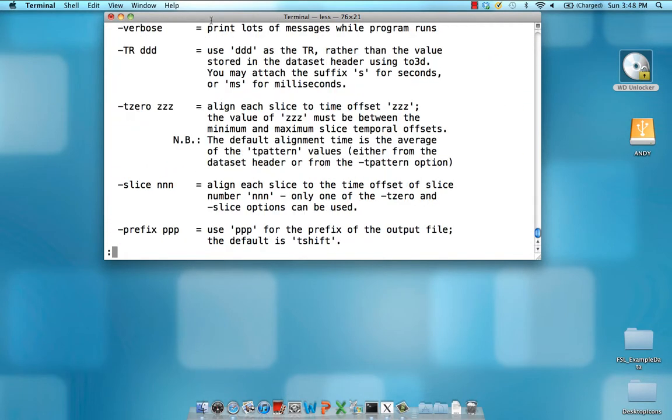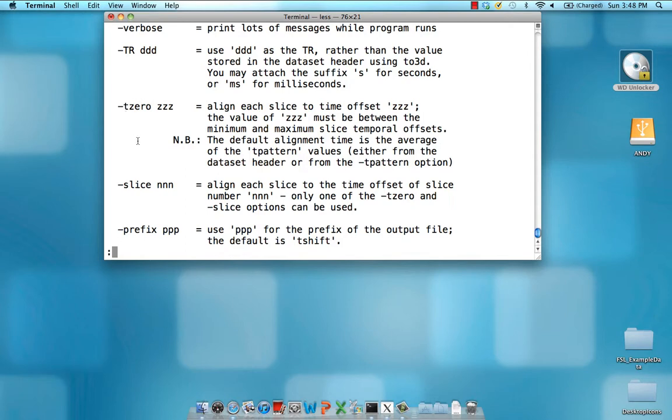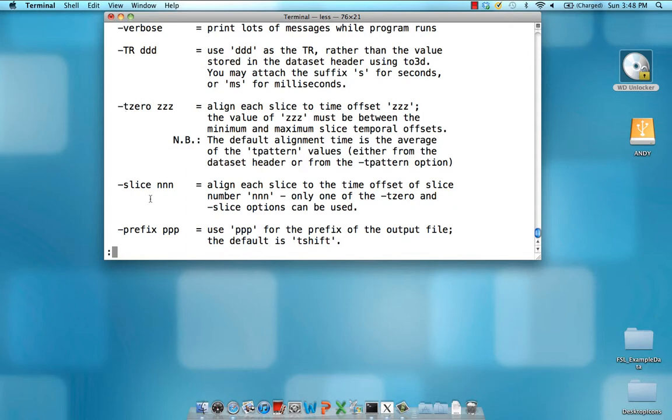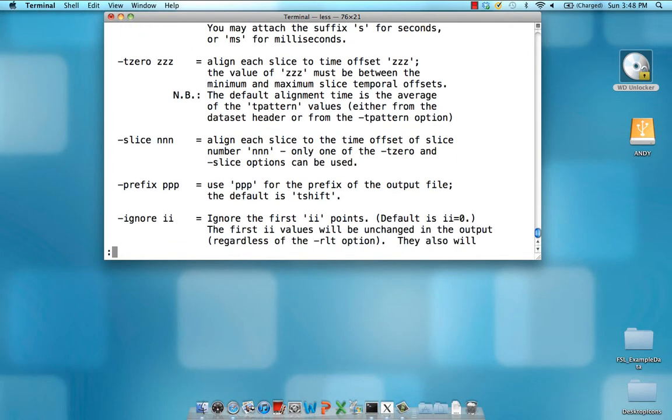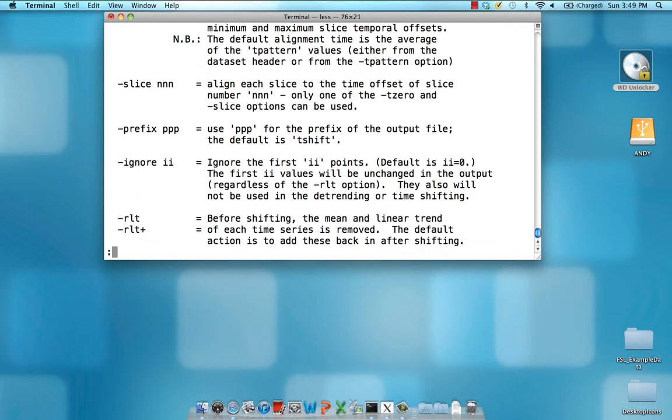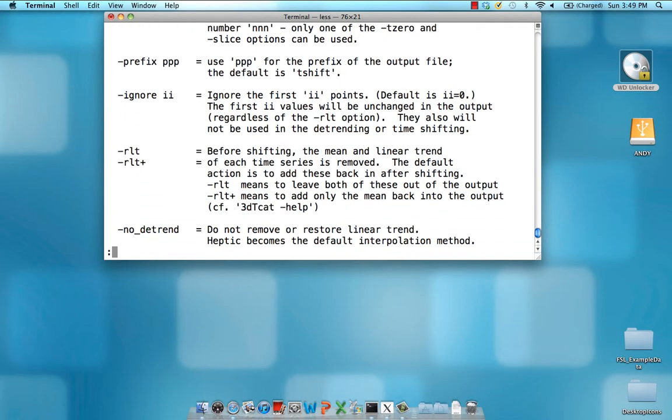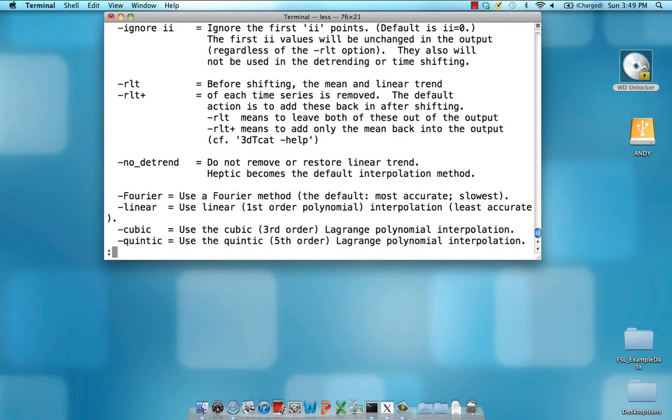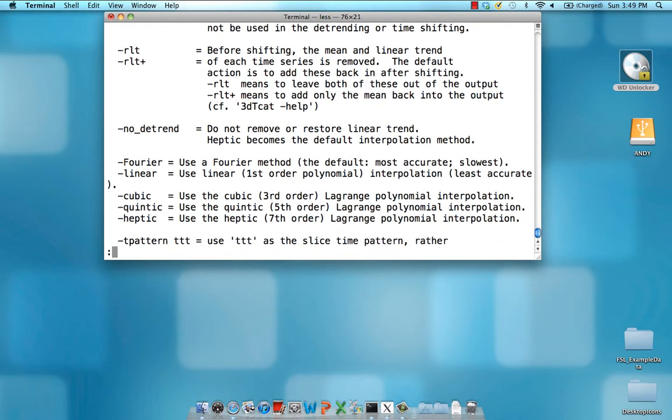Notice that there are different options here, such as you can override the TR stored in the data set. You can set what slice you want to align to. In this case, we're going to align to slice 0. And the prefix is the name of the data set that you want to output. What label do you want to attach to it? And there are other options that you can look at as well.